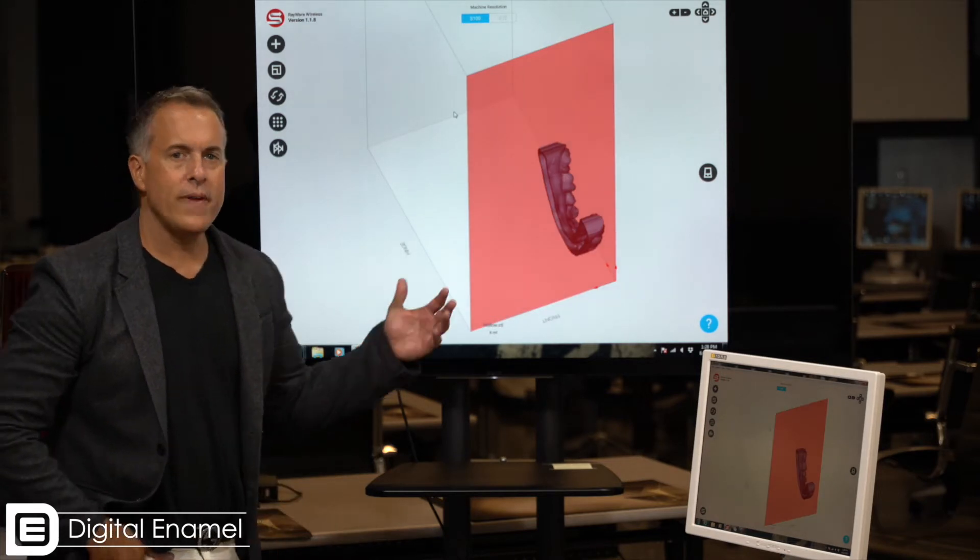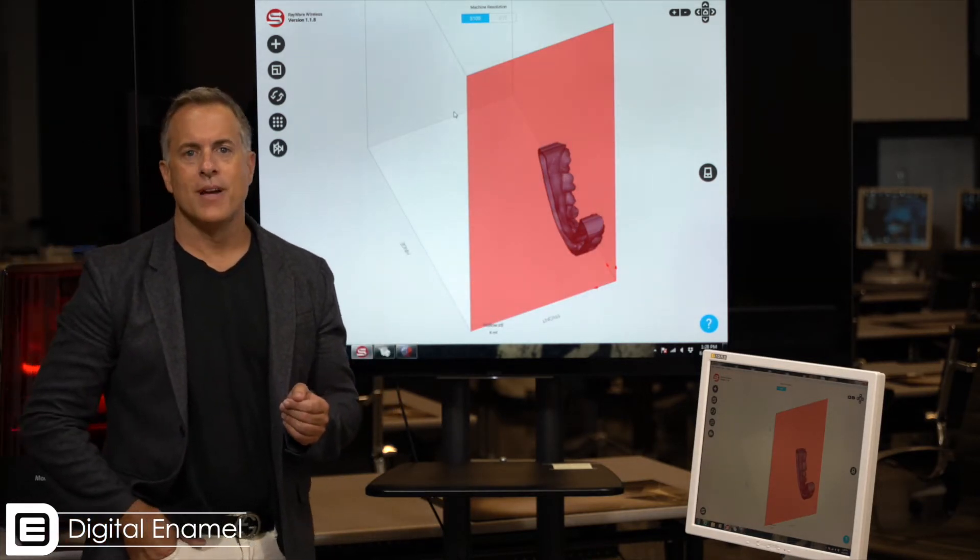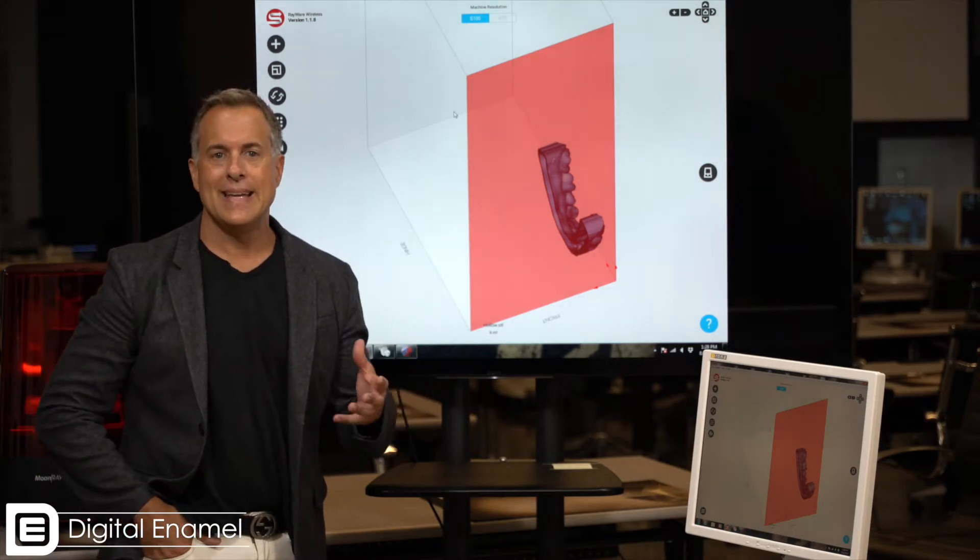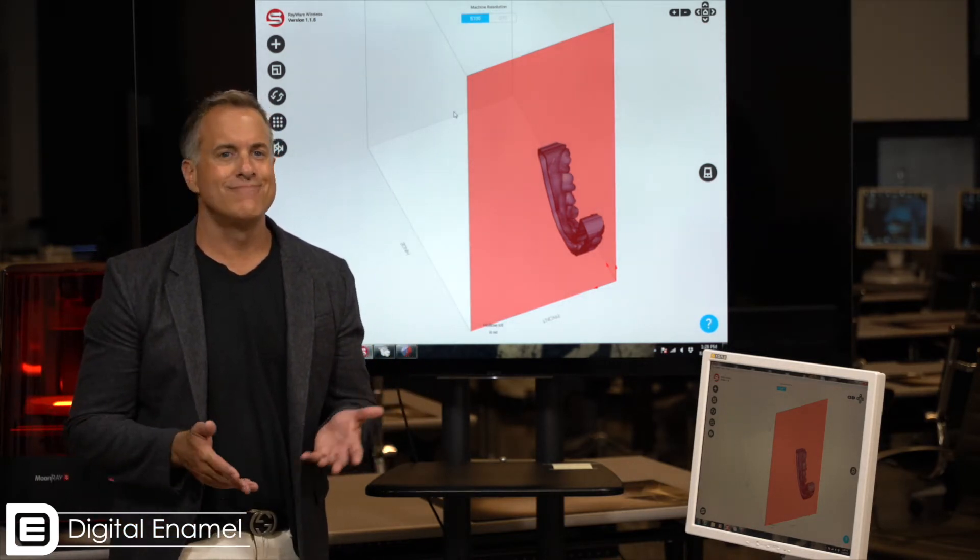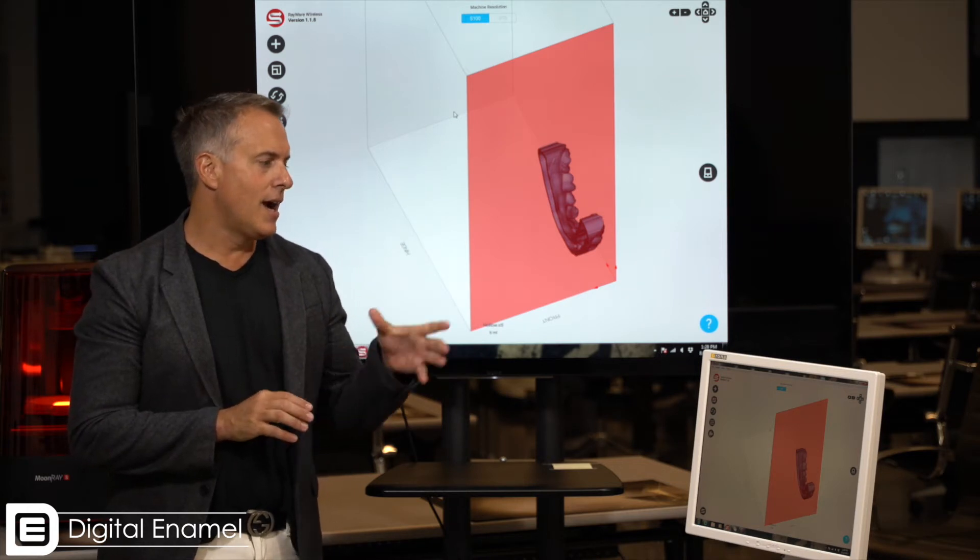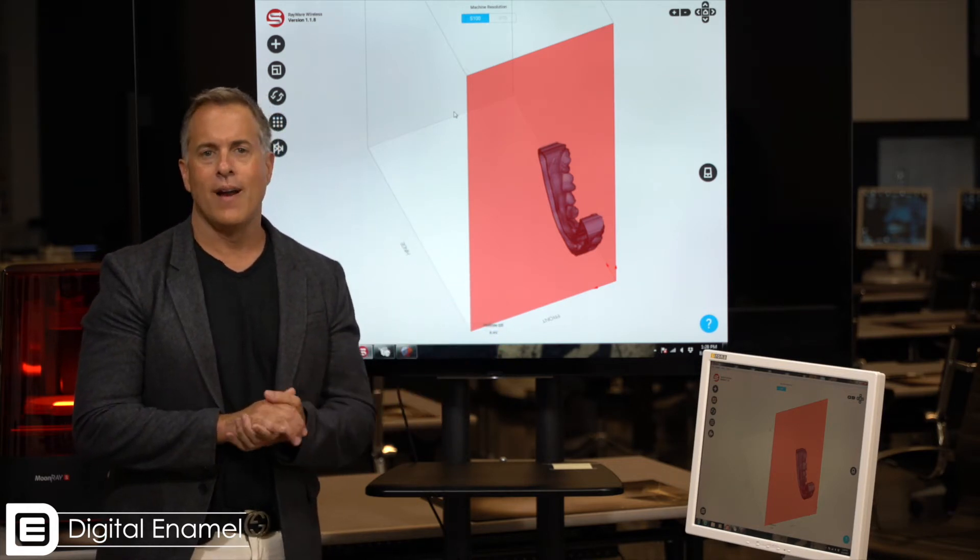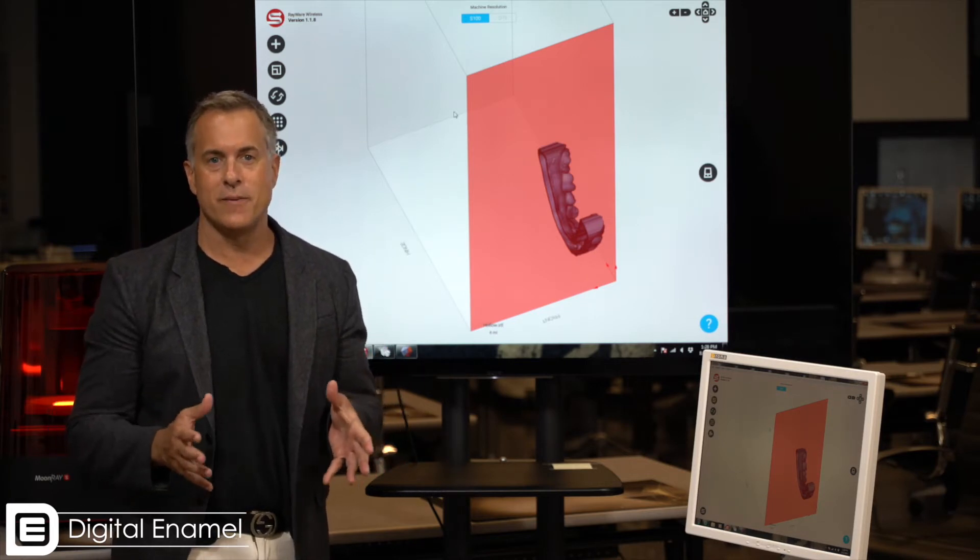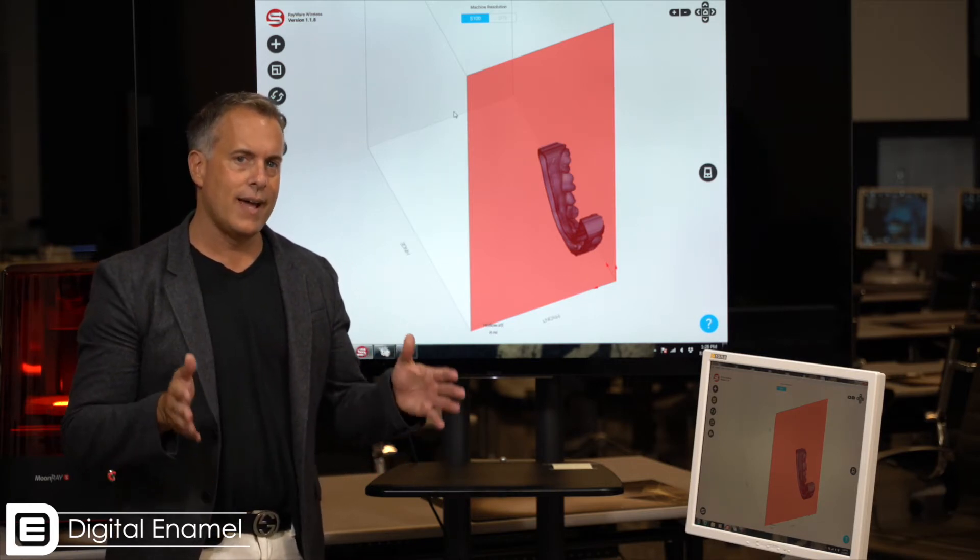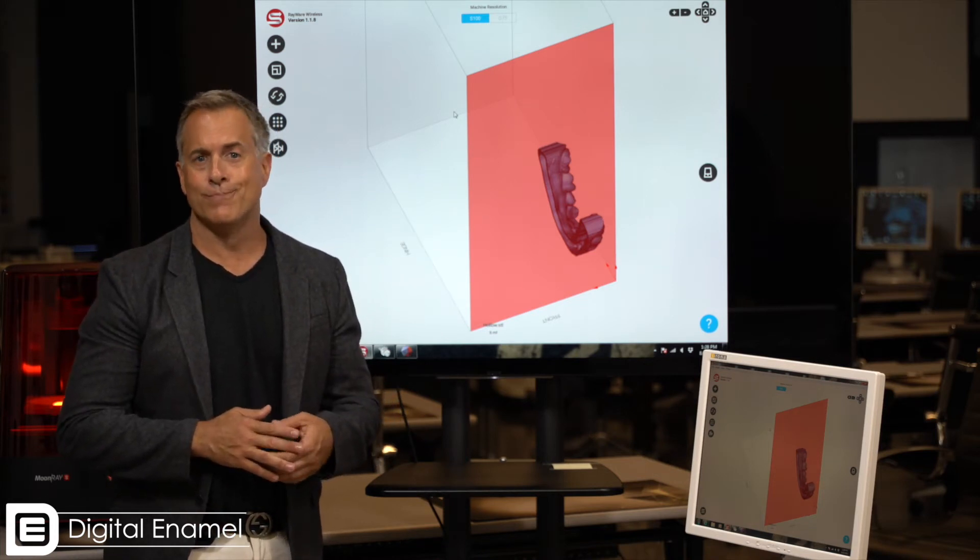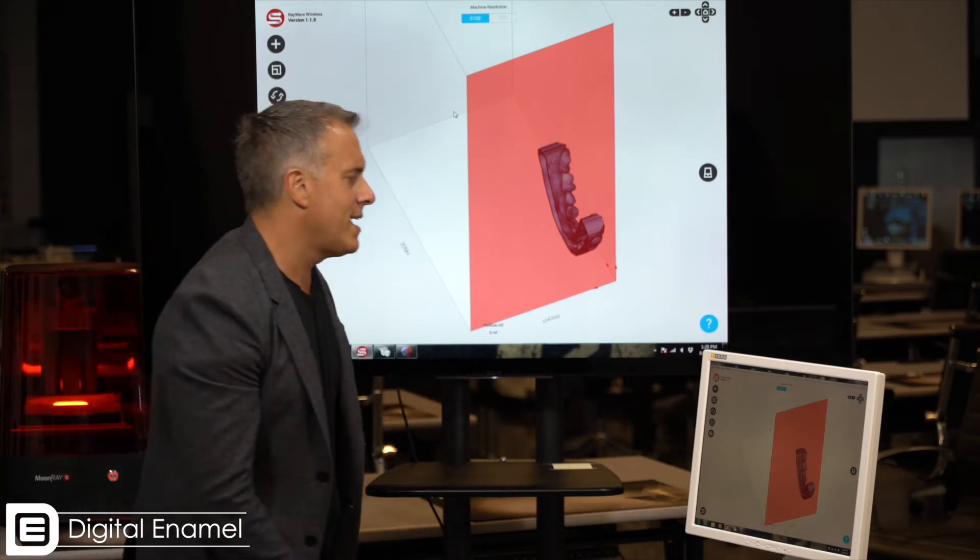So one thing that's very common in a lot of printer software is sometimes the model doesn't come into the direction that you want it. No big deal, I'll go over the steps to rotate it. One thing about the RayWare software is if your model is positioned outside of the build plate, you'll get a little red error message, no different than CEREC if your restoration is too big for your block.